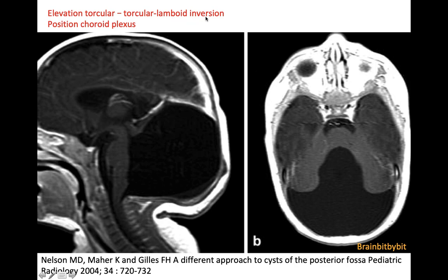On post-contrast images you can also look at the position of the choroid plexus, which is absent or displaced laterally in Dandy-Walker malformation.